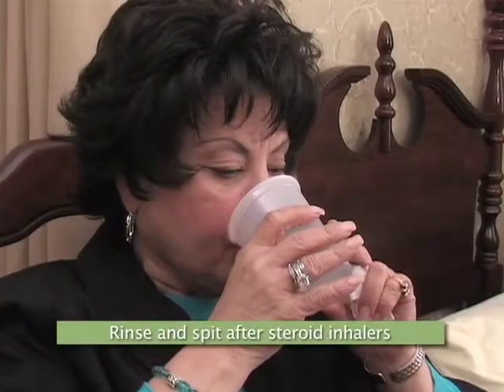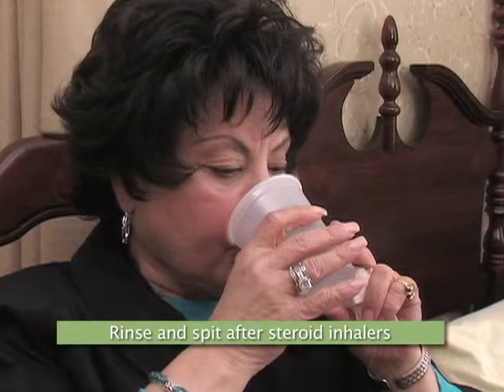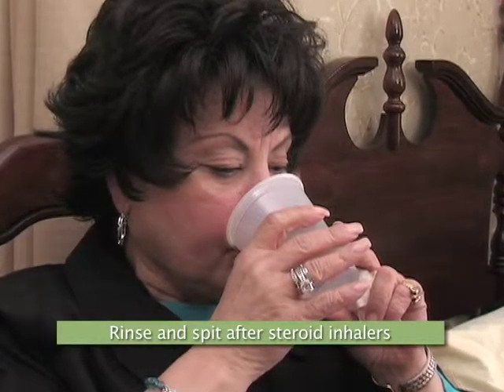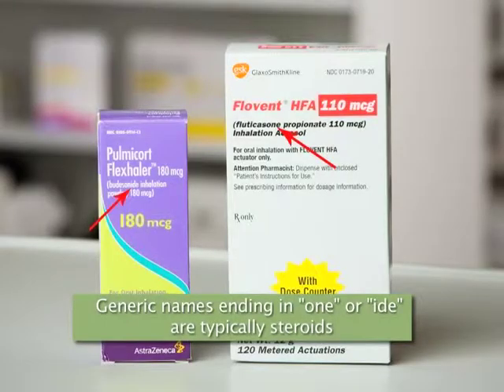When administering steroidal inhalants, be prepared with water and an empty cup, and instruct the resident to rinse and spit after using the medication to remove residue. An easy way to identify whether a medication is steroidal is to look at the generic name of the medication. If it ends in "-one" or "-ide", it's likely a steroid. Double-check this information in a drug reference, or ask a pharmacist if you have any questions.